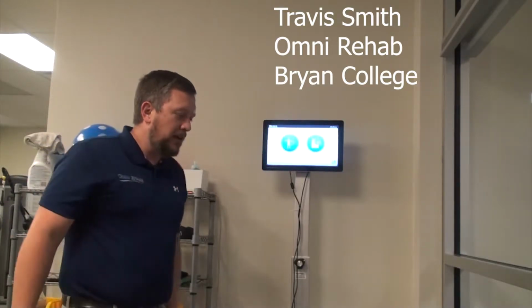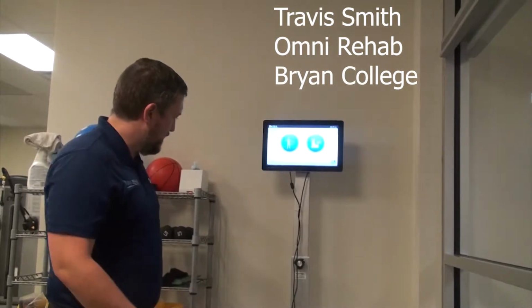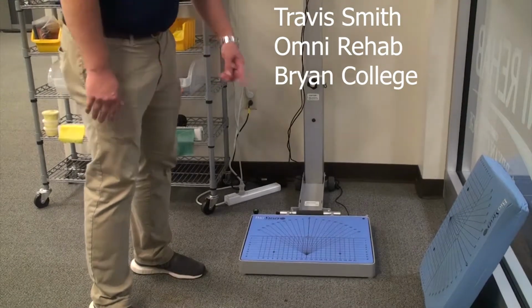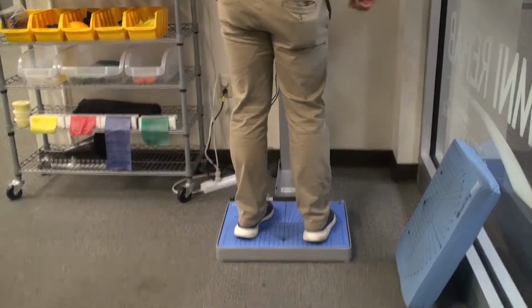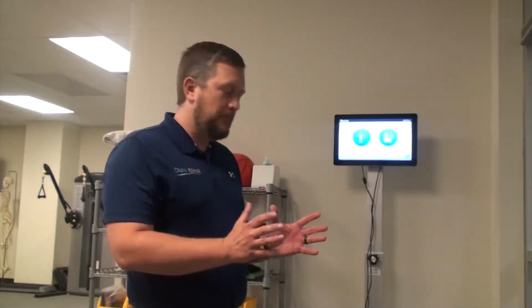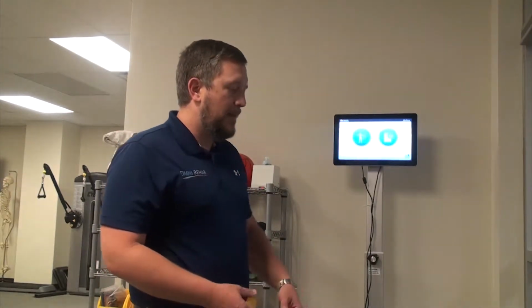We just wanted to tell you a little bit about the BioSway. Basically, the BioSway is a force platform that when we have an athlete stand on it, they'll stand with their heels here, and try to stand perfectly still for 30 seconds with their eyes open, and the computer will measure how much sway they have. Then I'll have them do it again with their eyes closed for 30 seconds, and then they'll step off.